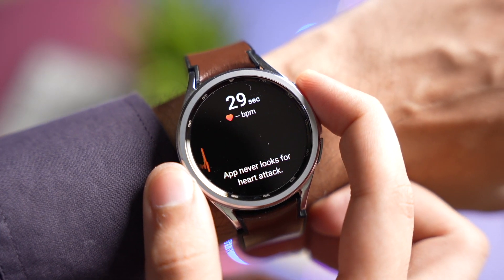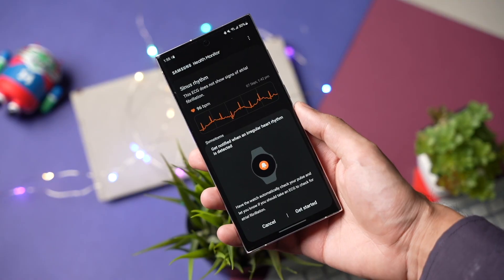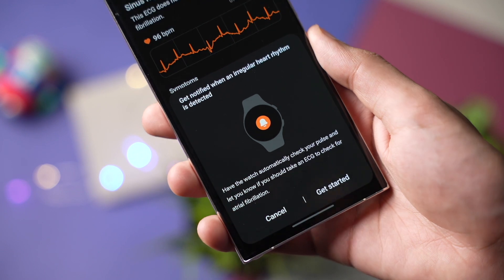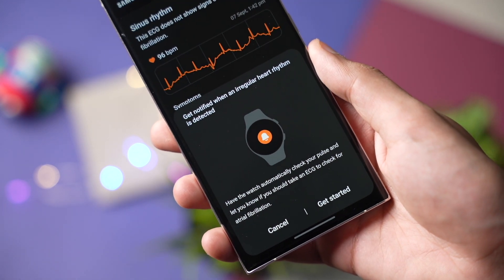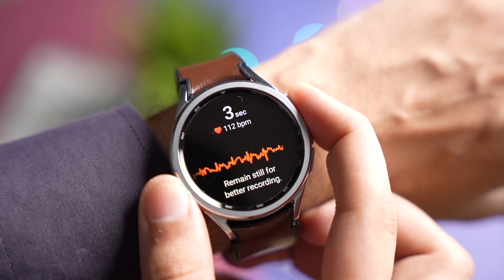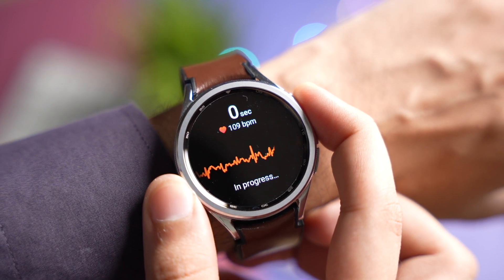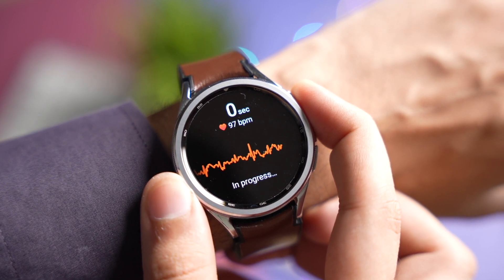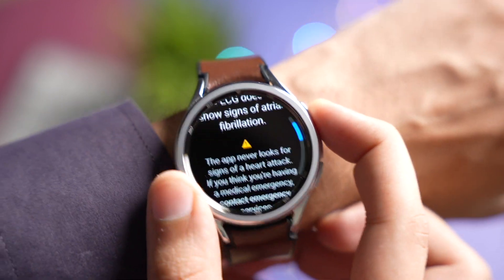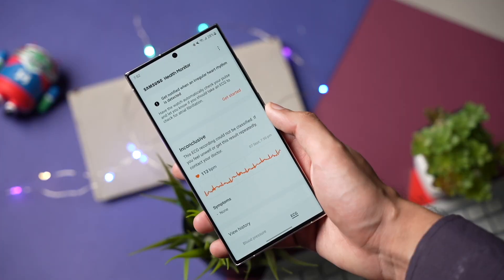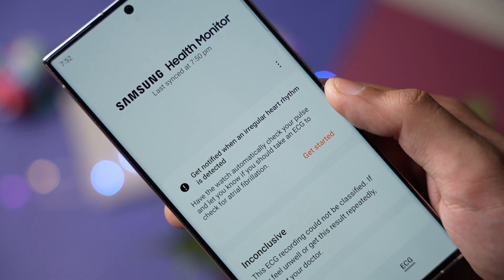Hi everyone, welcome back. In this video I'll tell you how to enable irregular heart rhythm notifications on your Galaxy Watch. This is a system recently announced by Samsung with One UI 5. It's available out of the box on Galaxy Watch 6 in supported countries, but Galaxy Watch 5 and 4 will be getting it too with the One UI 5 update.